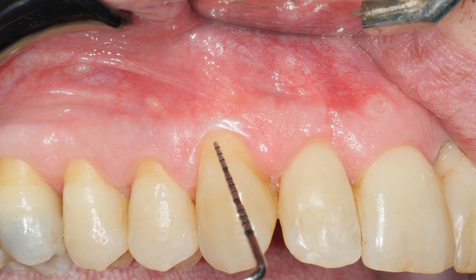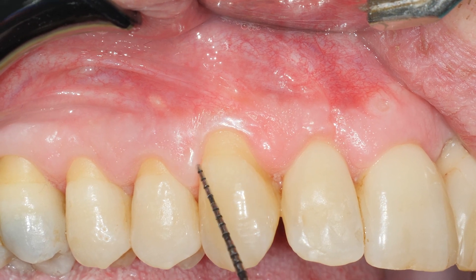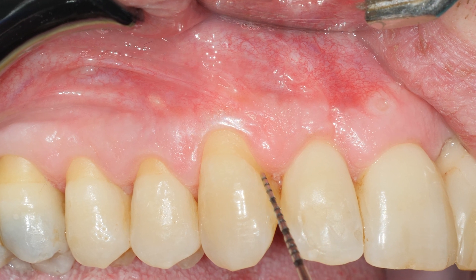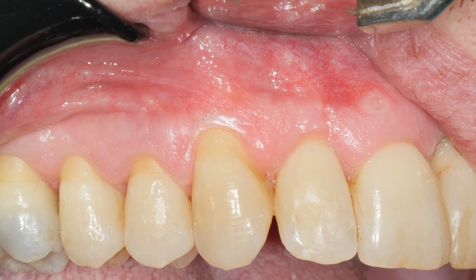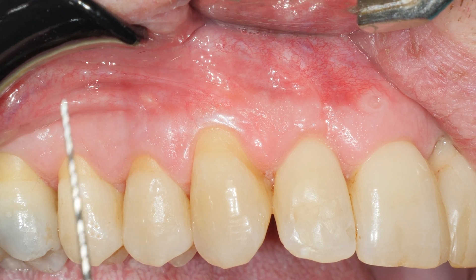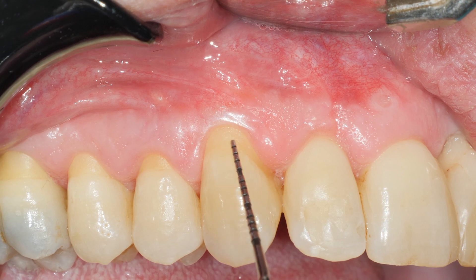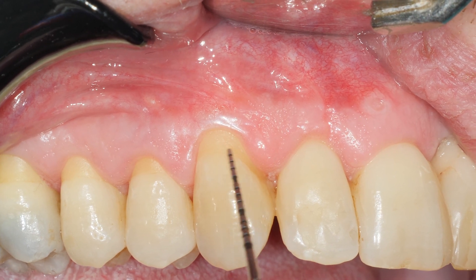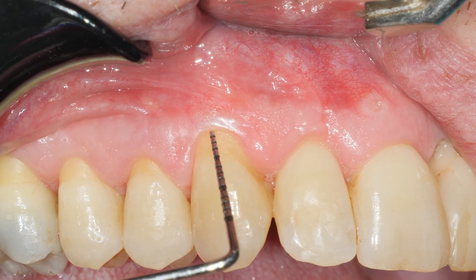This is the main patient concern with this canine, which is a little bit rotated. We know that rotation is a factor that can limit the amount of coverage we can obtain, but we aim here for getting 80 to 90 percent coverage.